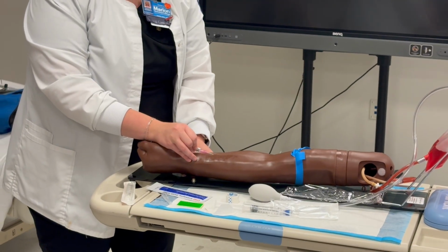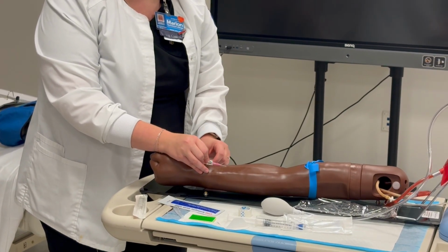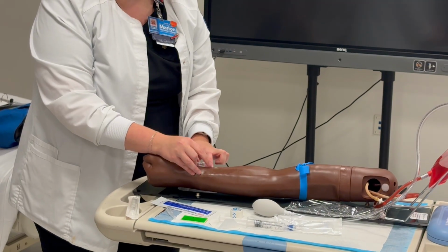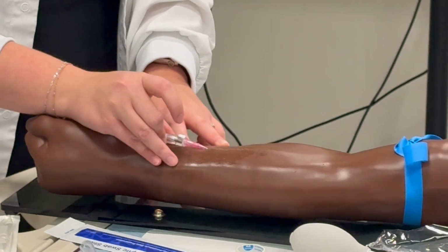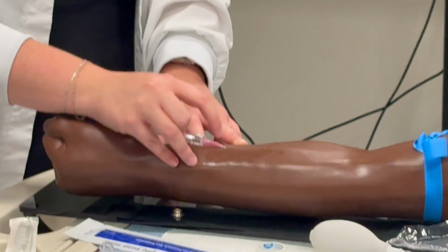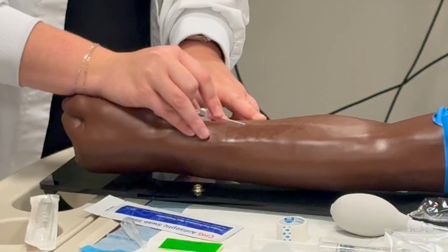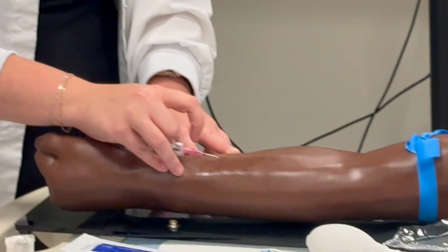I see blood return. So I'm pretty sure I have the IV. So you don't want to stick the needle in all the way like this. I'm going to show you the wrong way. You don't want to do this because it could potentially puncture through the patient's vein. So we really only need the pokey part to break the skin and then we thread. So that's why it's important that that little notch.